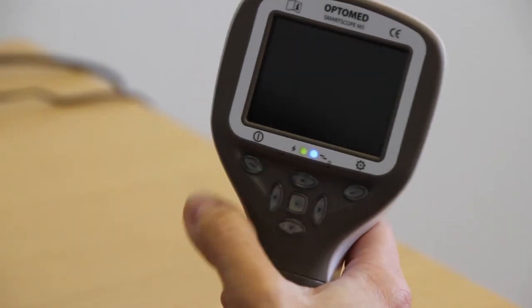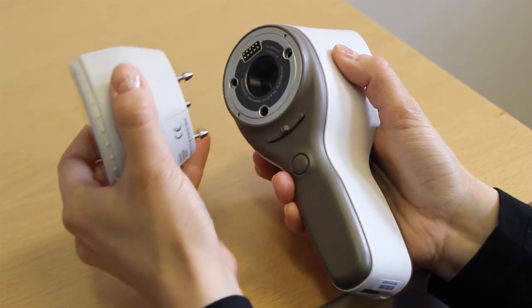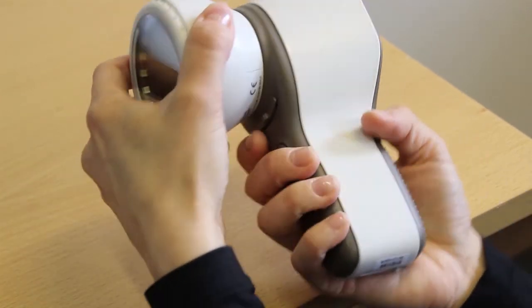Power on and off the device by pressing the left soft key. Attach the SK-1 Optics module by pressing it firmly into place until you hear a click. To detach the module, slide the release button.